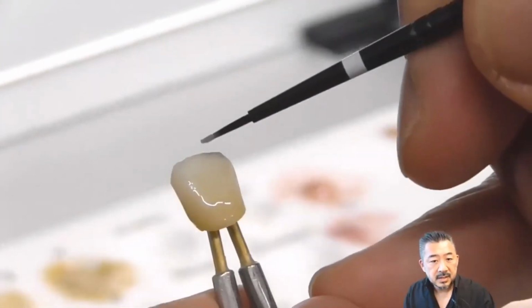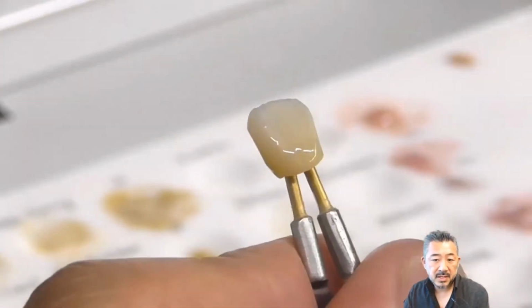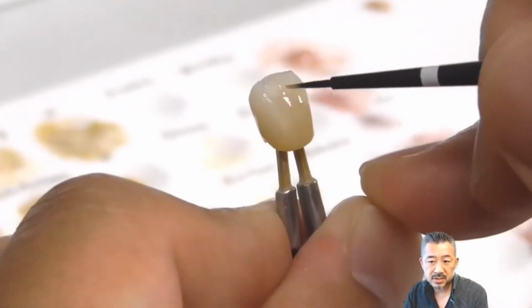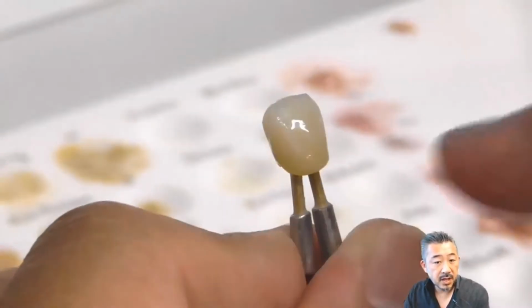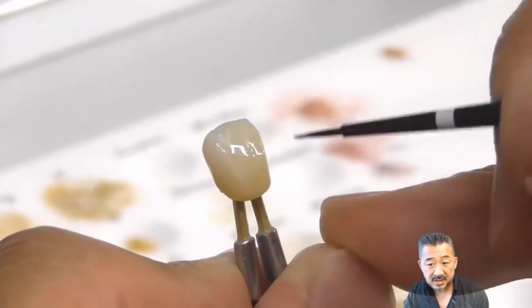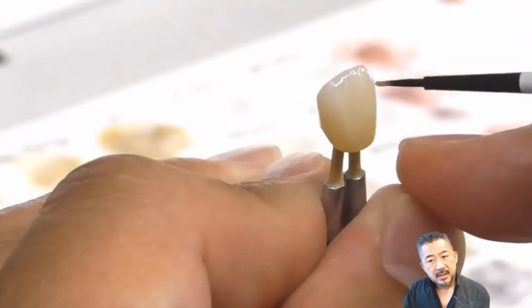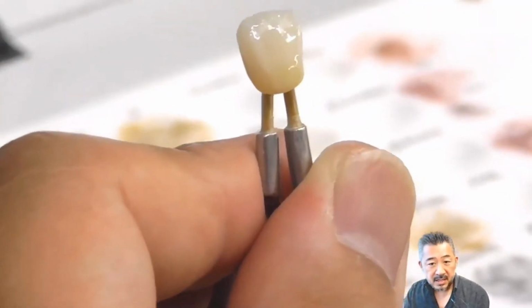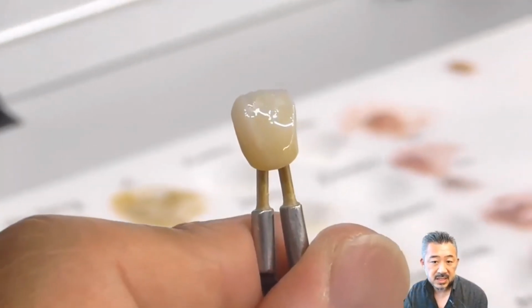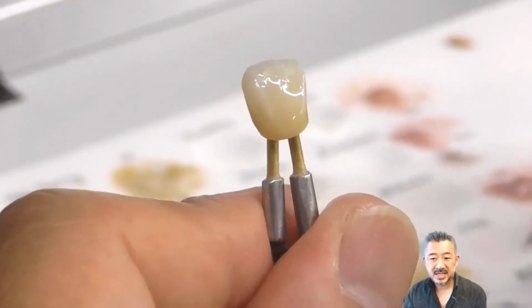I use this because I want to express transparency, but be careful because it becomes unnatural if you use it too much. Now you can see an orange paste is applied in a few thin layers, vertically around the blue area. By particularly adding warm color between the cold color, the transparency you want to reproduce in blue can be emphasized, I think.